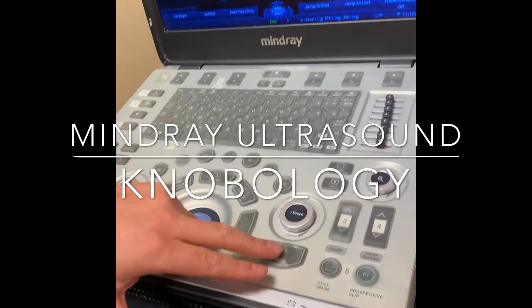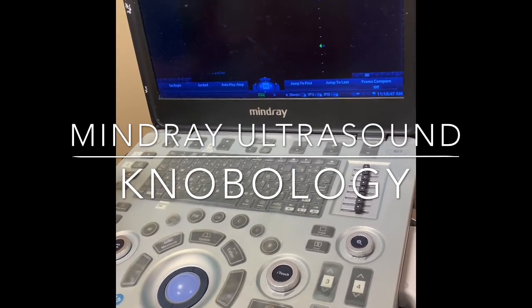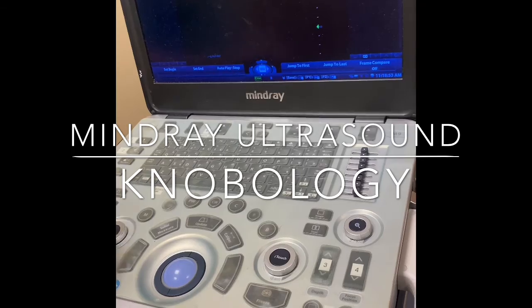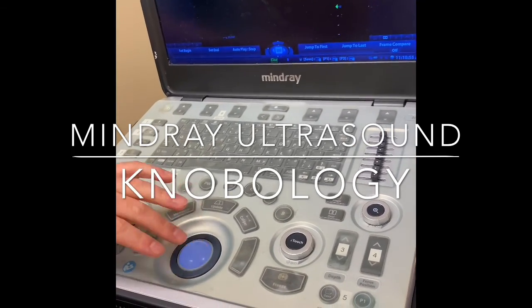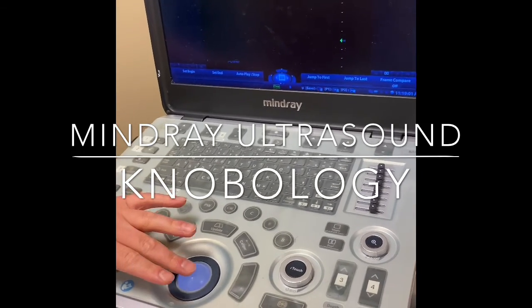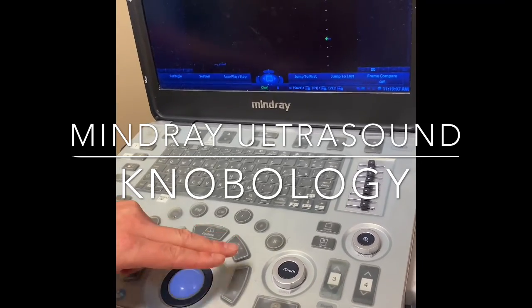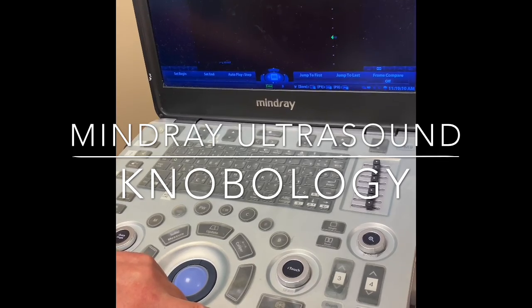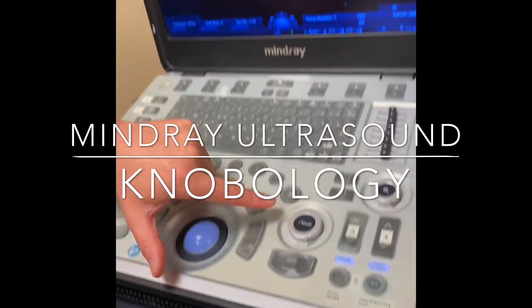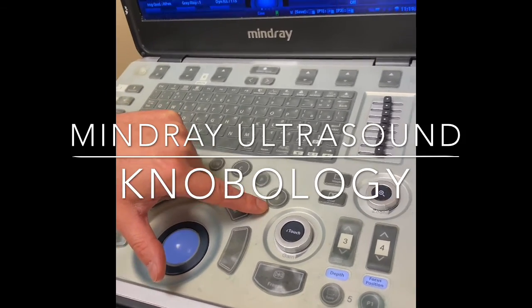The other function of this freeze button could come in helpful. If you see something while you're scanning, for example, the common bile duct, and then it comes out of view, if you press the freeze button, you can use the trackball to move back several seconds to look at images that were recently seen on the screen. Once you see the image that you're looking for, you can either save that image or make any necessary measurements. To unfreeze the image and resume scanning, you can click the freeze button again, or you can click B. This stands for brightness mode or B mode and is the standard scanning mode that we use.